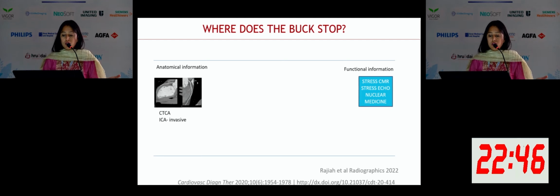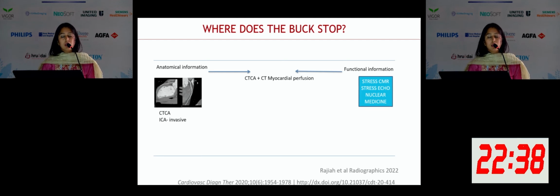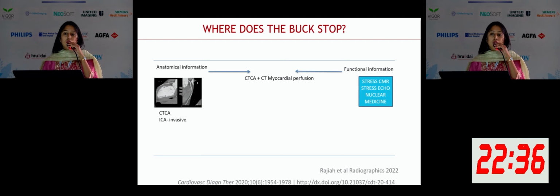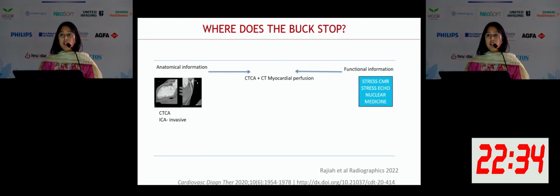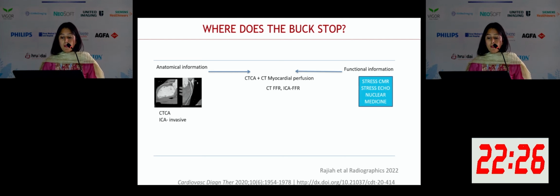So how do we marry these two? We can do CT coronary angiogram and CT myocardial perfusion. We had a fantastic talk by Dr. Kakuya the other day. The drawbacks are that you need a modern scanner, dual source CT, it is technically quite challenging, and it can increase the radiation dose as well.